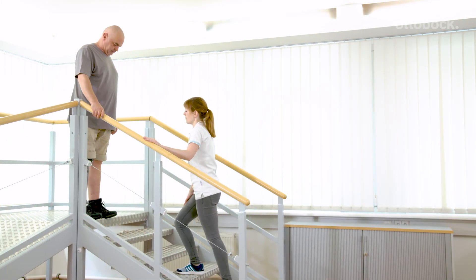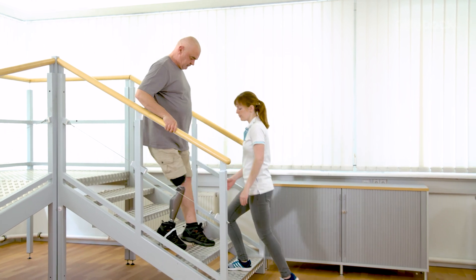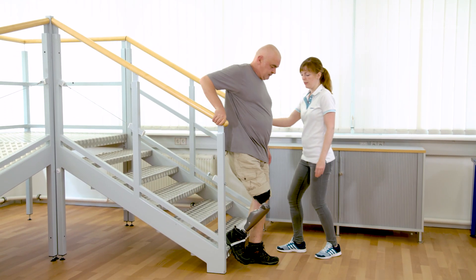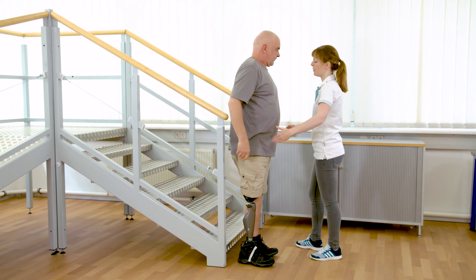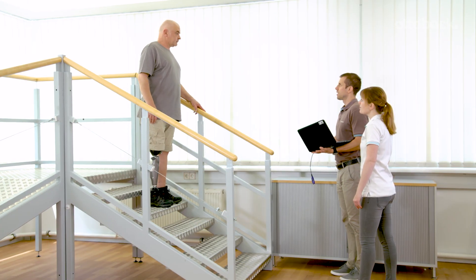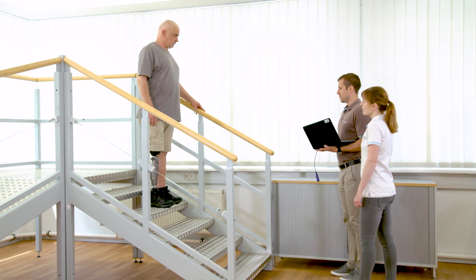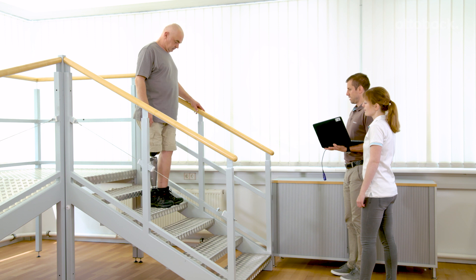Franziska changes the handrail during the training. That increases the intensity of the training since Gerhard must load the prosthetic side more. To see how the setting of the stance flexion resistance influences walking downstairs, it will be changed in small intervals by the OT.